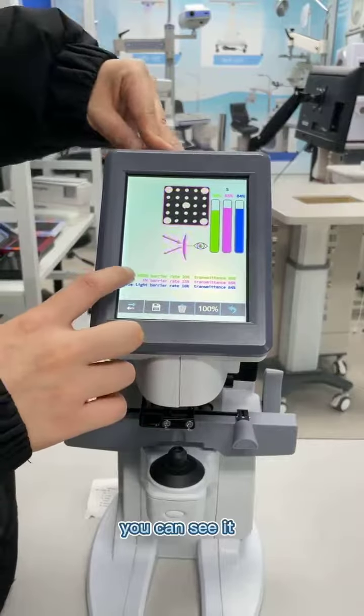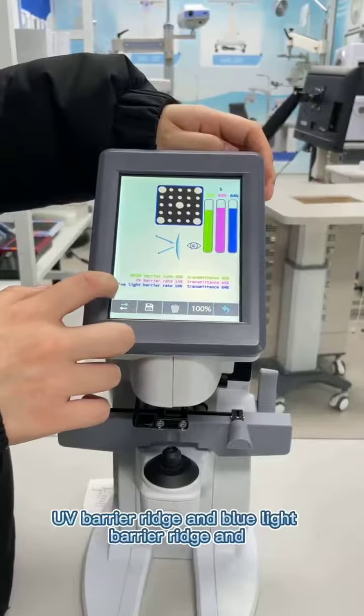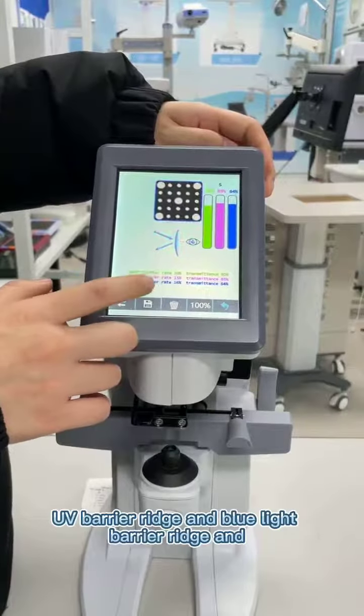You can see it here: the green barrier rate, UV barrier rate, and the blue light barrier rate.